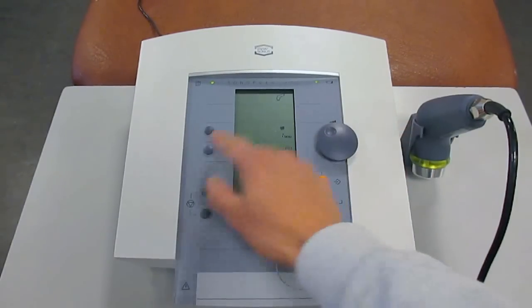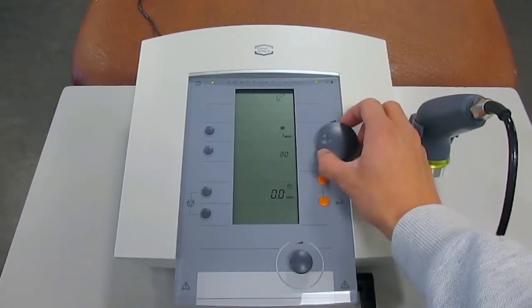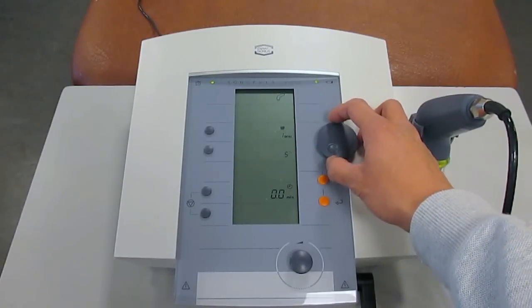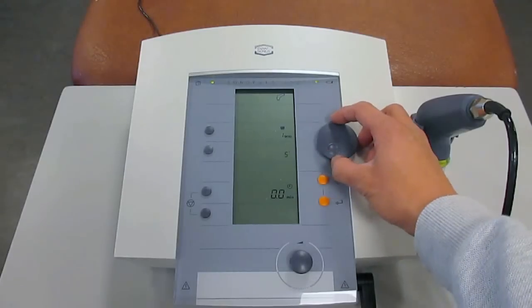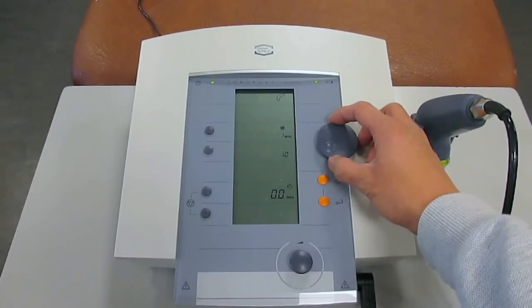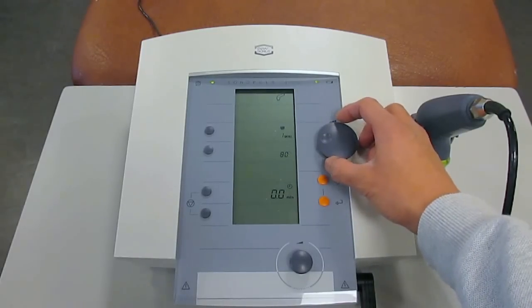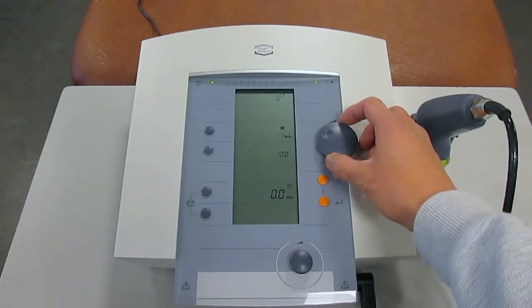For the Sonopulse 490, it offers you several pulse duration settings. There's 5%, 10%, 20%, 50%, 80%, and 100%, which is continuous ultrasound.